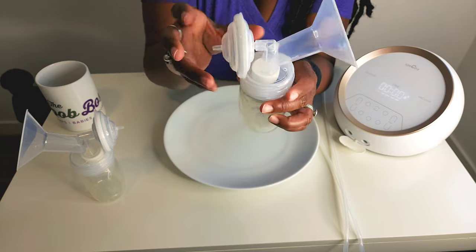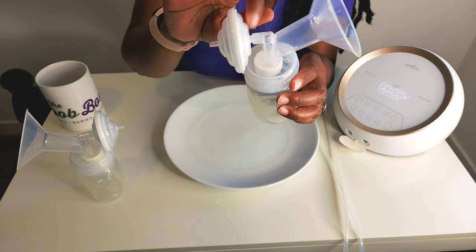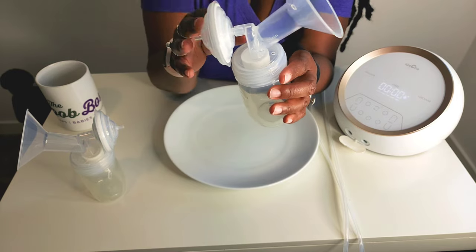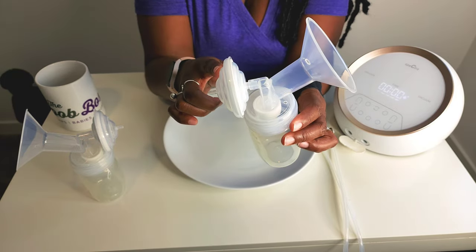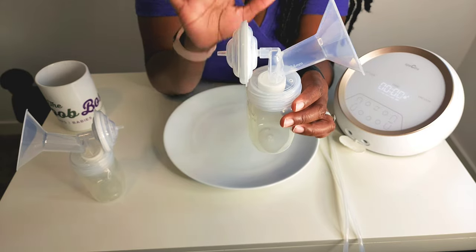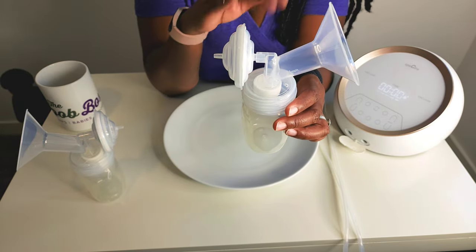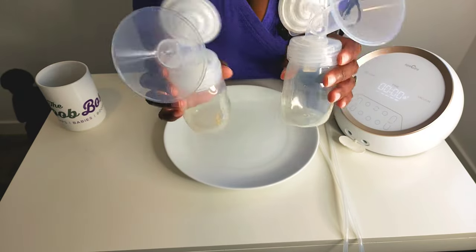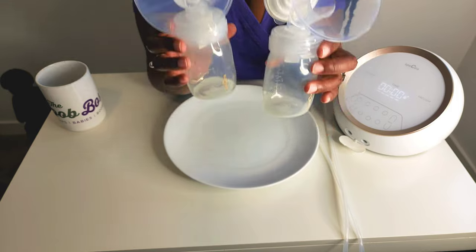Be careful with these. A lot of times this will actually break off. So you do want to put it on there nice and snug, but be careful. I have had a couple of these break, especially when I use the S1. It would just break off right there, and then you have to replace them. Spectra does have replacement pump kits that come with tubing and everything else. So that is how you put it together. And once we've got both of these ready to go, we are ready to pump.